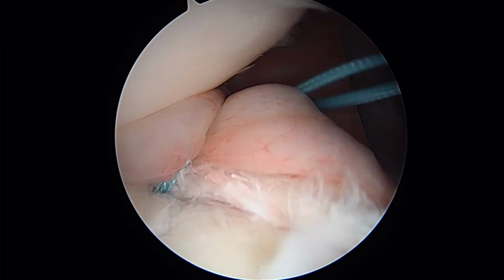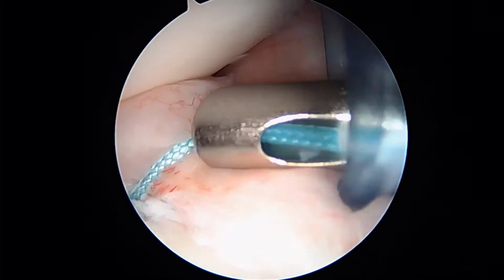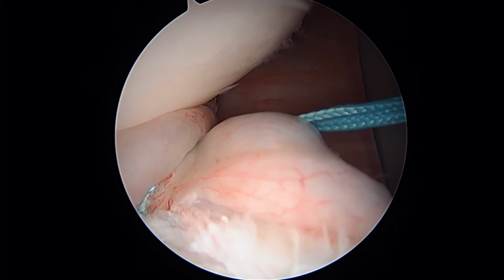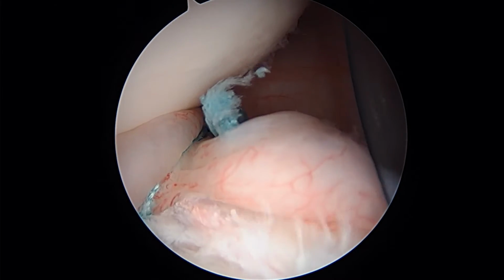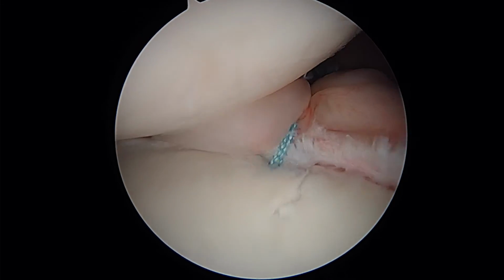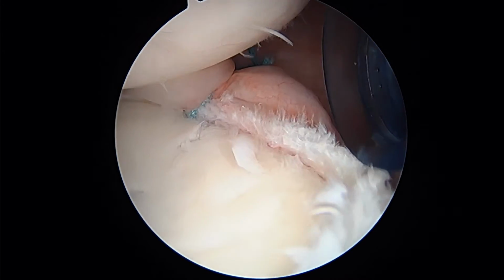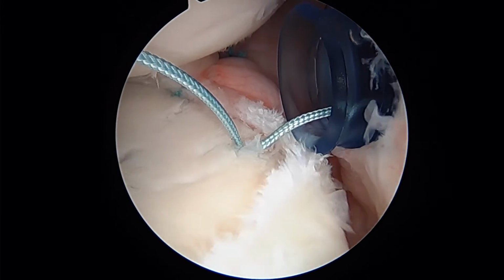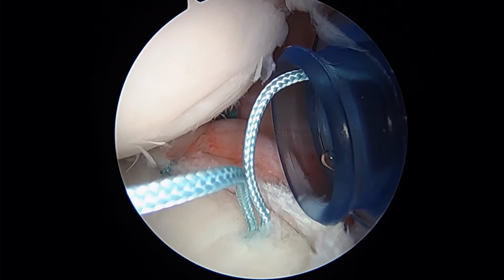This is the last one here. Okay, so there's the first one. Now we're going to place one more just to the right, which is a little bit superior. Shaver, did you turn to the left to me? Okay, so there's our next anchor in. You can see how it looks there.